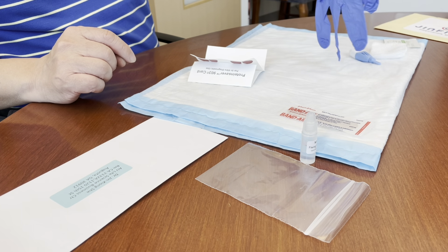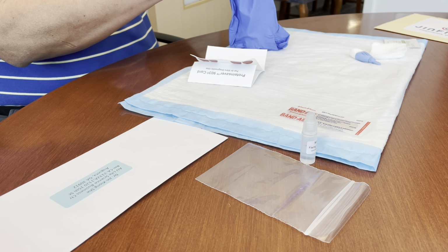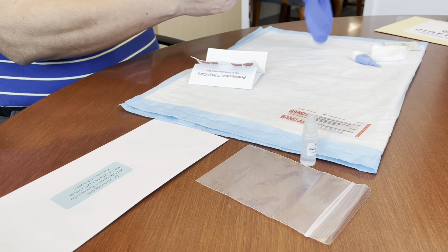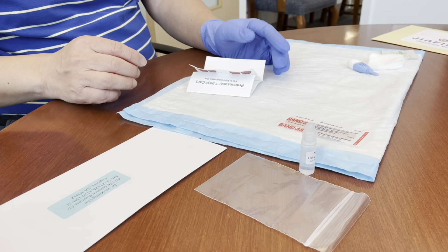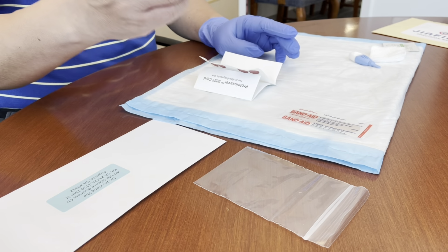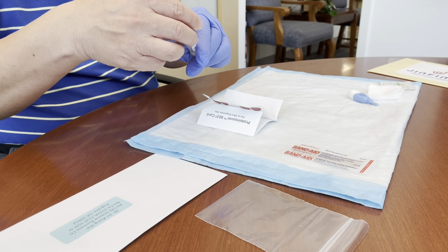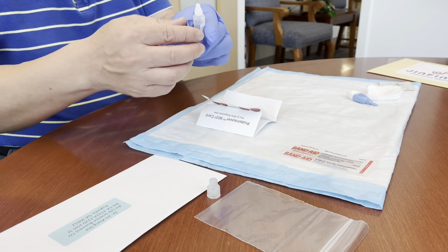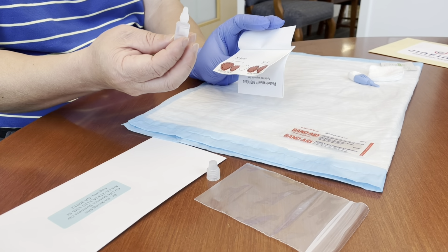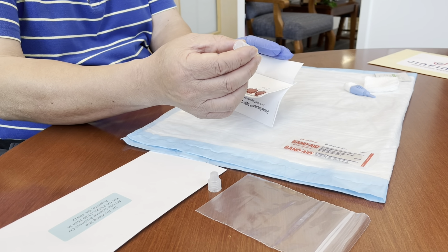The last step is to fix 2 of the spots you have collected. You may wear a glove over your bandage if you wish, but the NAD fixing buffer is non-toxic. You will add NAD fixing buffer only to the 2 blood spots marked Fix. Open the bottle of NAD fixing buffer and, holding the filter paper card up, invert the bottle and squeeze gently and slowly.